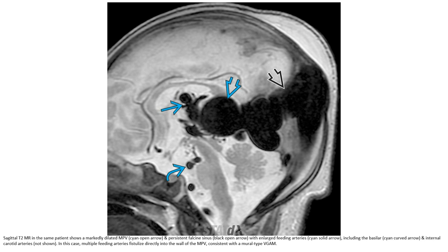CT angiogram in the same patient shows a markedly enlarged median prosencephalic vein and persistent arteriovenous shunting with large feeding arteries, including basilar and internal carotid arteries. In this case, multiple feeding arteries fistulate directly into the wall of the median prosencephalic vein, consistent with the mural type.